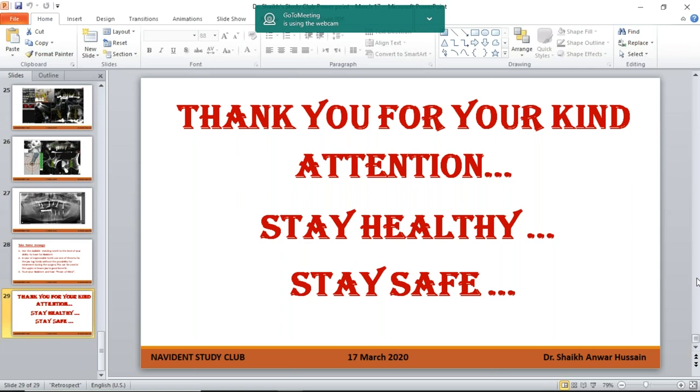Thank you. Okay. This was asked by whom, doctor? Dr. Lapeche, okay, I'll give you two reasons for it. First of all, placing the head tracker is not easy if the patient is restless. Because in my part of the world, there is a lot of movement during the time of surgery. It could be due to anything, but there are those kinds of movements which can lead to a little bit of shifting of the head tracker from its place.